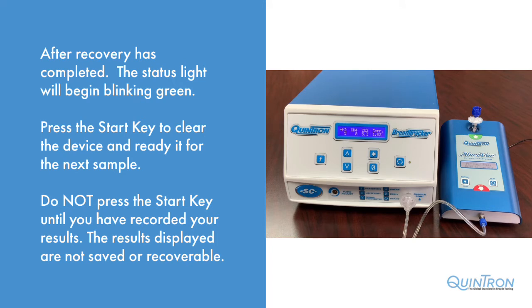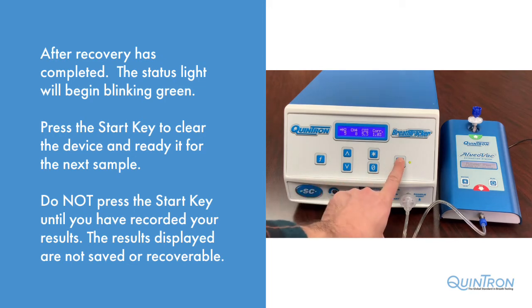If you press the Start button, it will clear the previous sample and ready the device for the next. Do not press the Start button unless you have recorded your values.